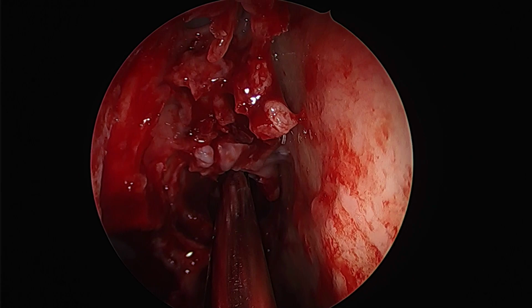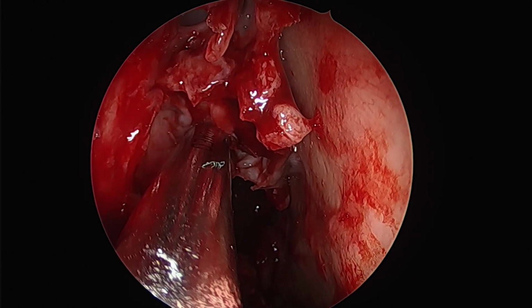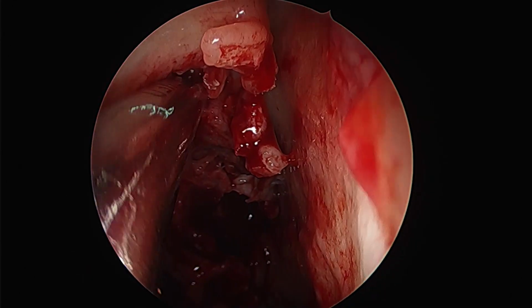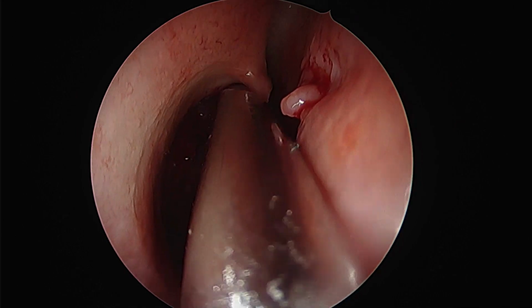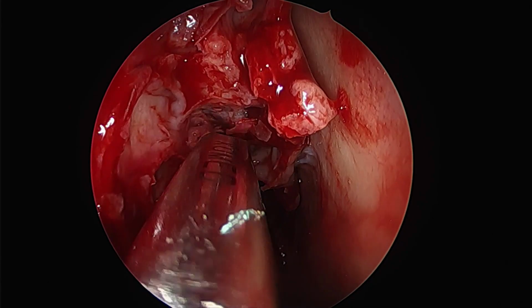So we see here, as the middle turbinate is removed, the space constantly increases. The deviated septum is not bothering us anymore. The ethmoidal cells still have some attachments at the base of skull which need to be taken down to create a flush wound amenable and conducive for repair.